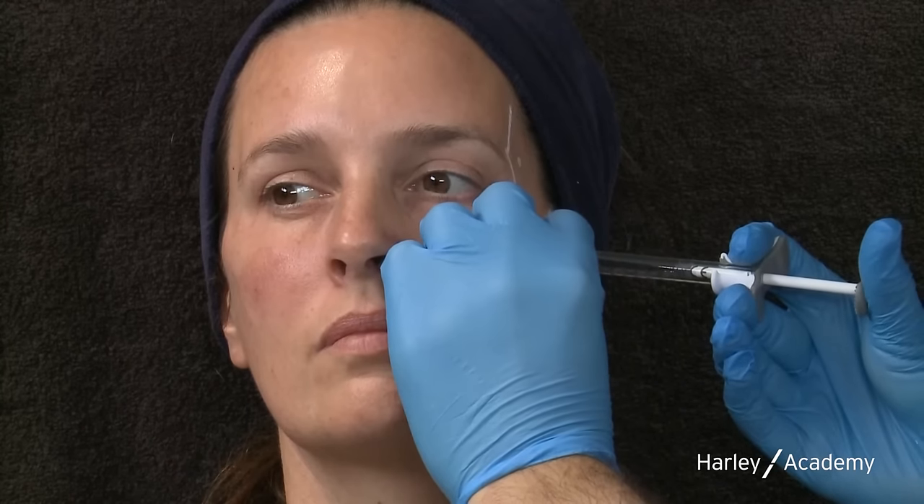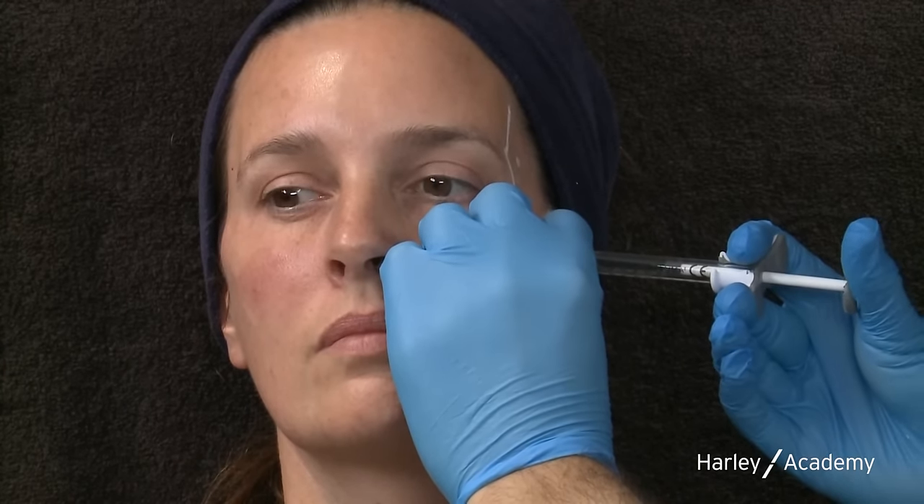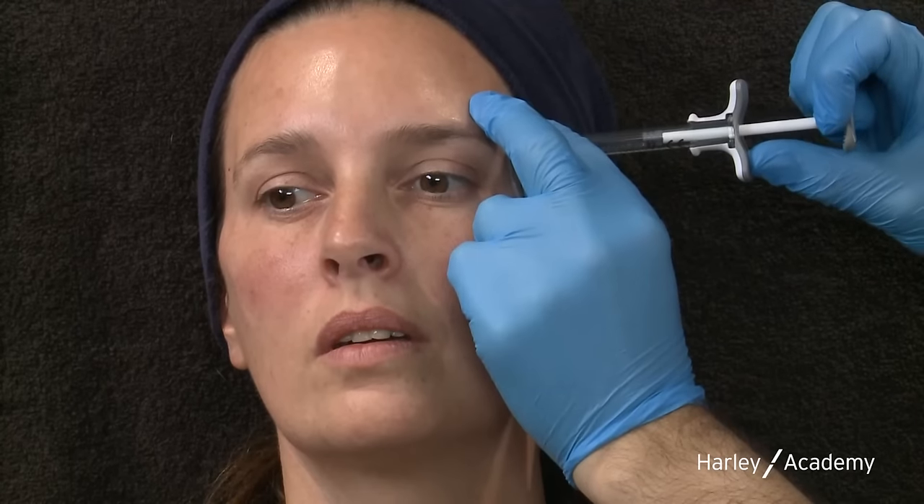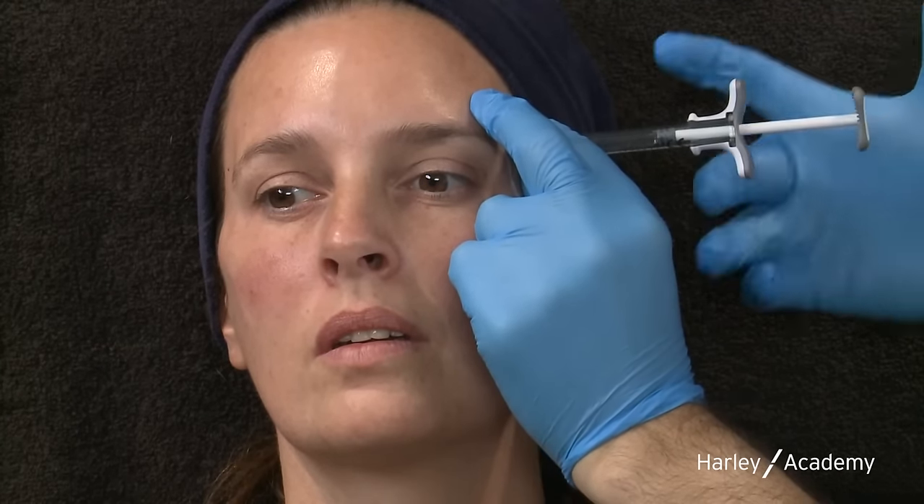Not very many use a cannula here — most just treat the bony area with needle. When you start out it's often how it's taught: three boluses on bone. But you often have patients with great cheekbones up to mid-pupillary line with flattening in the middle. When you get to grips with using a cannula for the deep medial fat pad it can completely transform that part of the face. As we age, the lateral aspect doesn't lose much projection — it's more the deep medial fat pad that goes first. Being able to treat that well can completely change the tear trough and under eye area. Doing tear trough before treating the deep medial fat is a losing battle — you're better off revolumizing the medial cheek first.